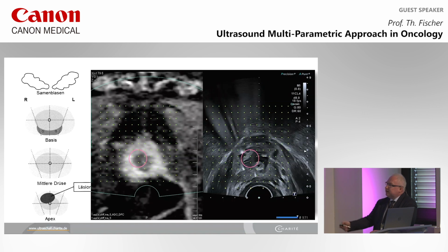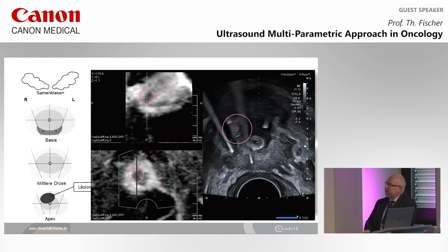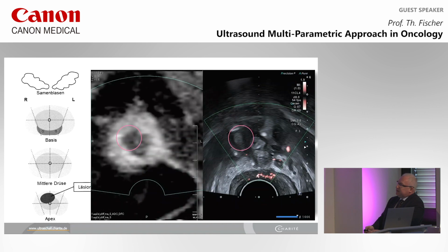Once again, the diffusion-weighted imaging, the small tumor, and 4 additional needles in the surrounding tissue of the tumor. The needle tips are very well depictable based on B-mode ultrasound. Second scan plane, linear transducer. You see exactly the area of interest with this mode. Then switch back into the axial scan plane, and then you can start your procedure immediately. You have to control the perfusion of the rectal wall, which is, in that example, correct. And then we have this gas formation here in the area of the tumor.